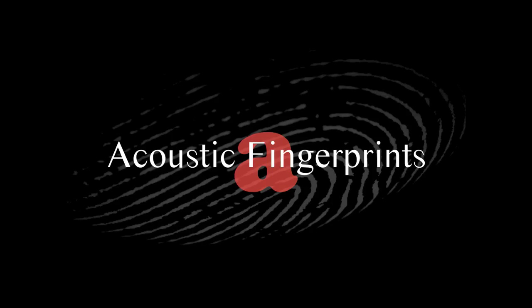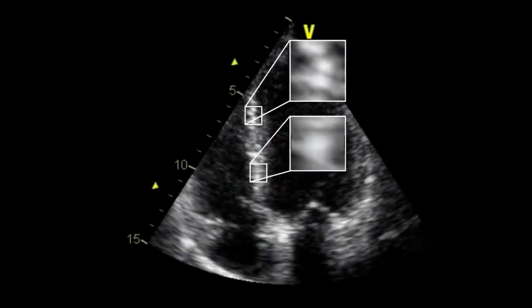And it relies on unique acoustic fingerprints, or speckles. And these speckles are generated by interactions between the ultrasound beam and myocardial tissue. And they're identified within a defined region of interest. And then we can track them frame to frame throughout the cardiac cycle, the distance between them giving us quite a bit of information about what's happening with both regional and segmental myocardial deformation.